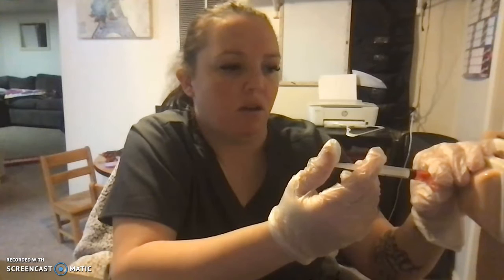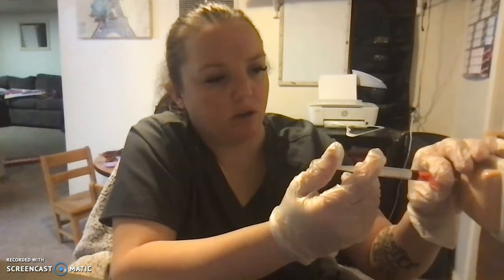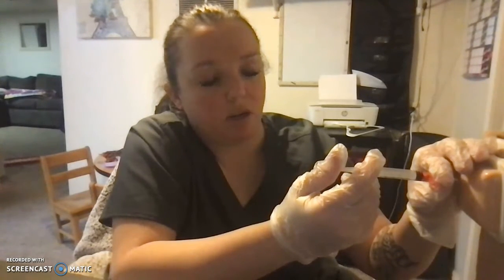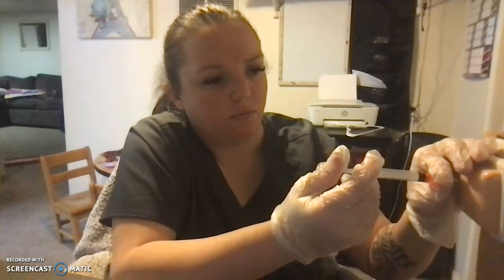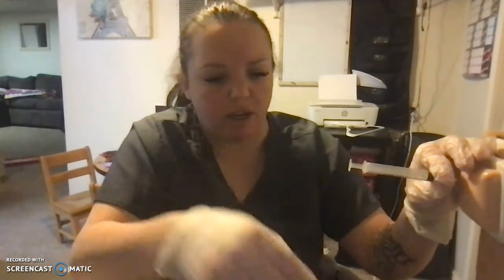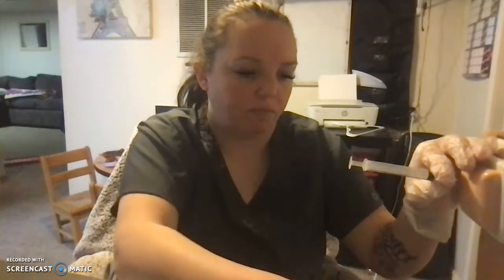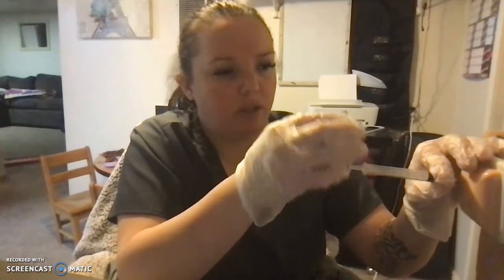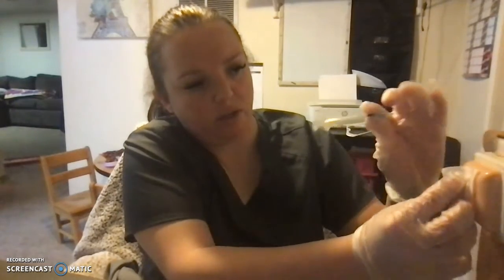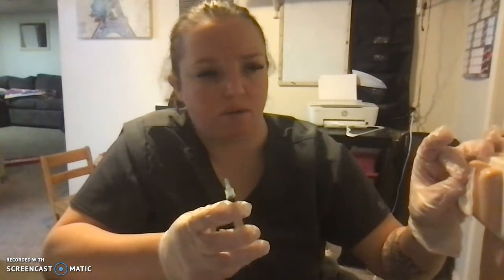20 seconds maybe, just to ensure that I'm not causing any pain or anything. Then I would hold it steady here for a minute to ensure all my medicine got into my patient's arm. I would have a gauze pad here. When I remove it, I will remove it. I won't massage the area.